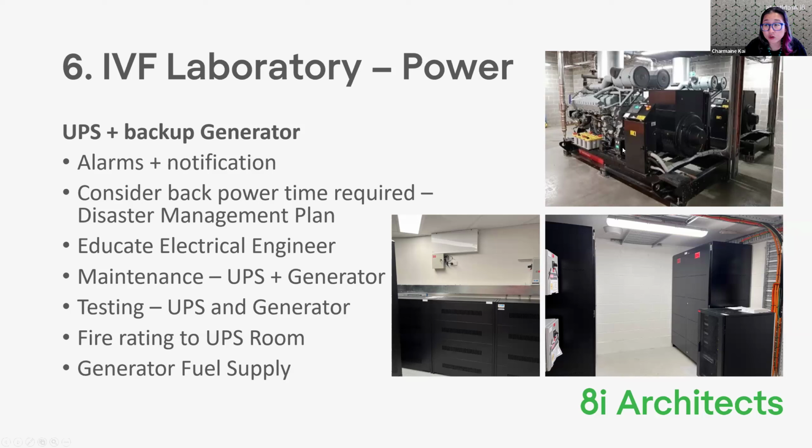Also with the generator, make sure that you have an agreement in place for fuel supply, because once the generator gets going, if it's a prolonged period without power, you'll need to top up the generator. Make sure that you've got a fuel supply to be able to keep that generator running.